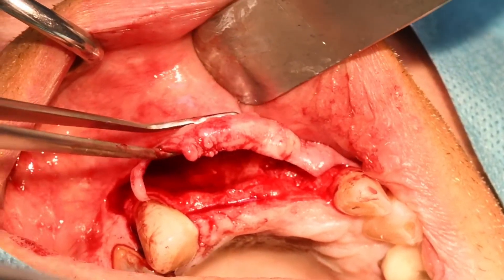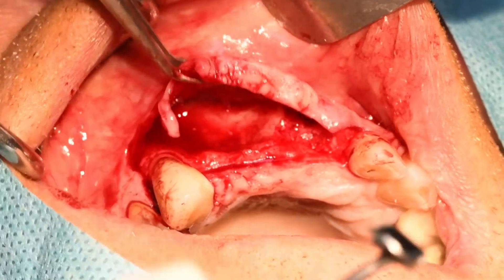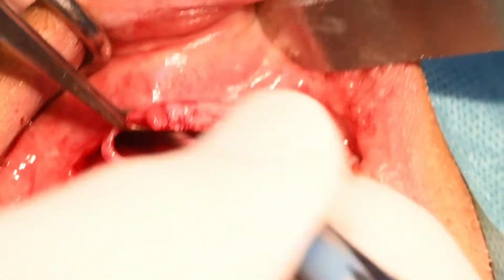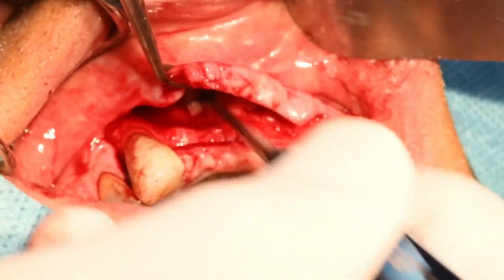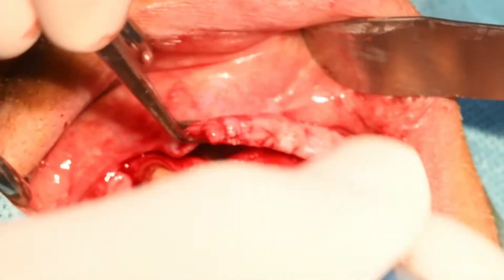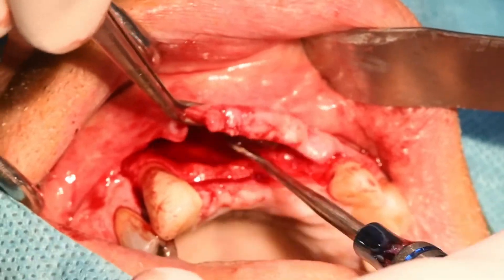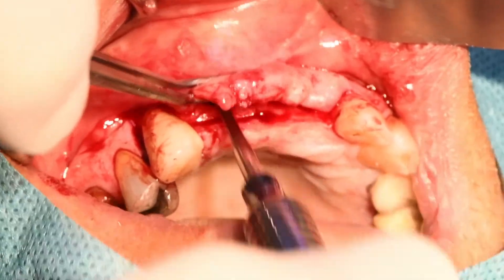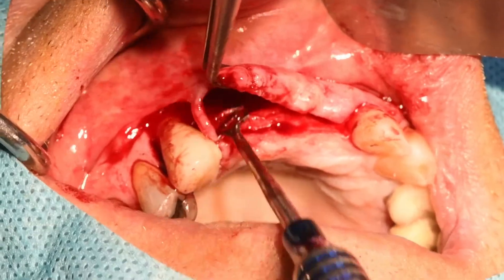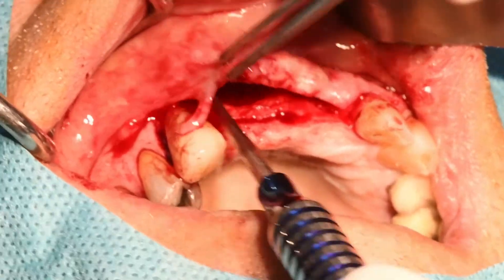Tu peux tenir là ? C'est bien. En faisant les brosser — donc on fait un brossage. Le plus dur étant celle-ci parce qu'on est sur la gencive kératinisée. Ici déjà on peut gagner un peu de laxité. C'est pas mal.